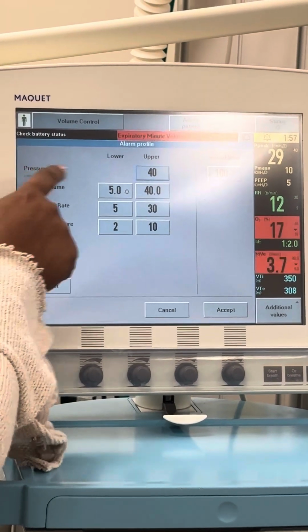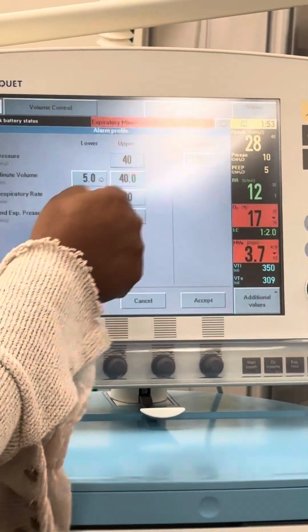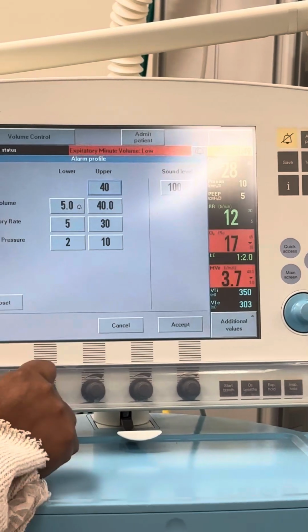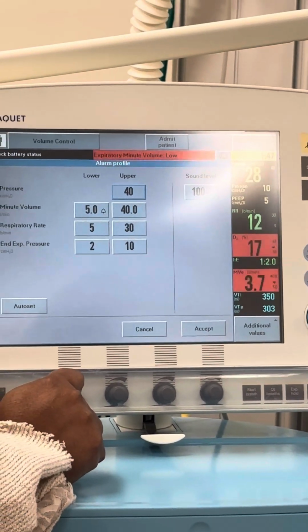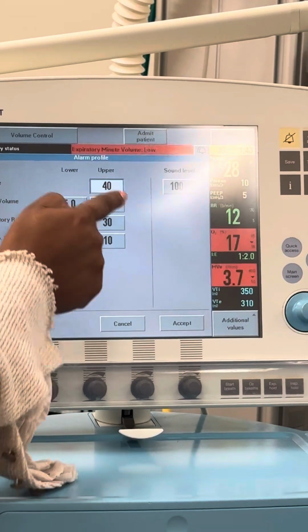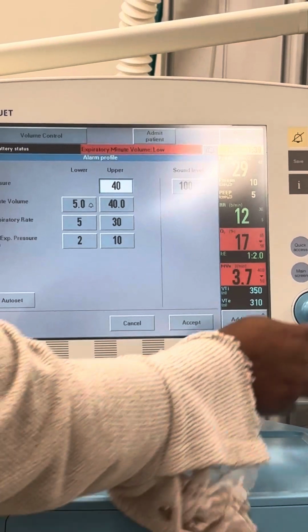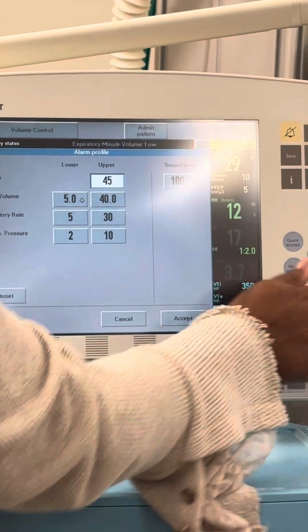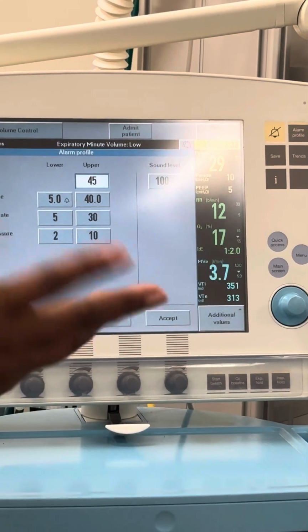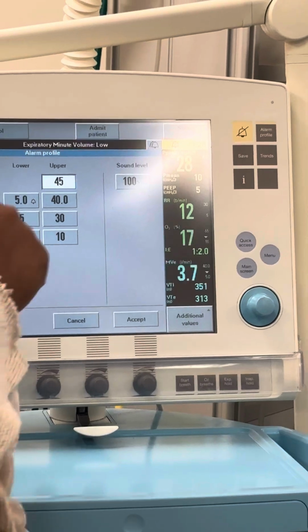So pressure pretty much is the first one, it just does not have a low one. That one did not either. So where do I read my pressure? Remember I'm over here. My PIP is 28. What did Miss Temple say to go in your pressure? 10 to 15 above. All right, so what's 10 above? 38. So you want like 40 something? 43 would be all right. 15, I'm going to do 45. All right, which you can do that. That's 17, I know, but let's just live on the edge. You're going crazy.